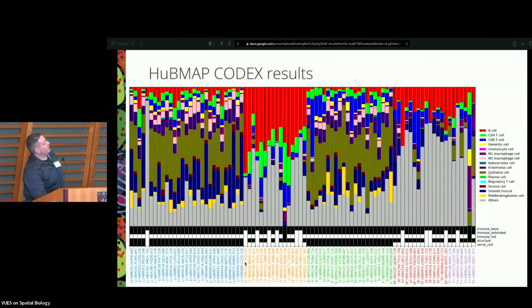And yeah, as we said, there's heterogeneity even between the panels that are applicable inside, for example, lymph node and spleen and thymus. Typically there's a lot better coverage for large and small intestine. So thanks to the Stanford TMC for that.